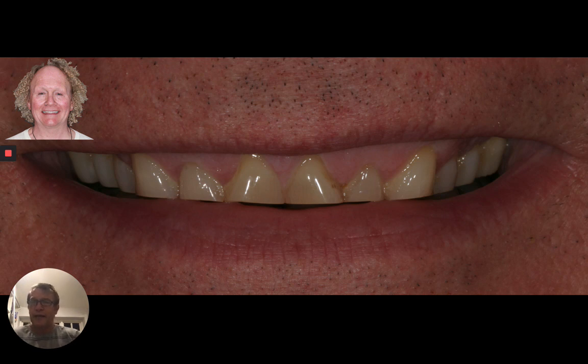Once we have the provisional restorations in place, we'll talk a little bit about how to contour those to make sure that everything is just the way that we would all like, and then how simple it is to move forward. Once you've scanned those, we take some photographs, send that to the lab, and they can copy the function and develop the aesthetics that we've started with so that we get beautiful, predictable, long-lasting results.